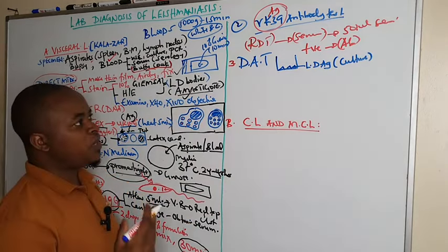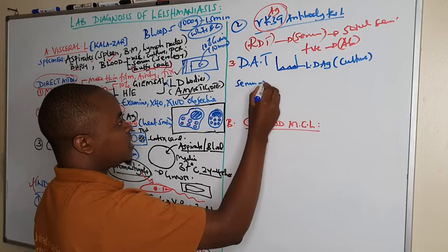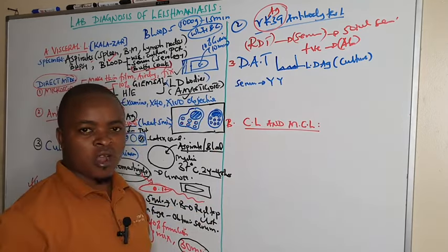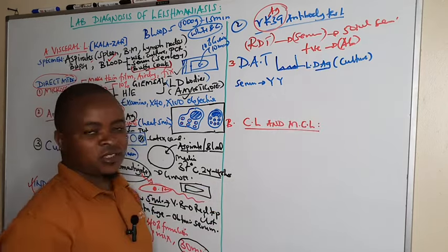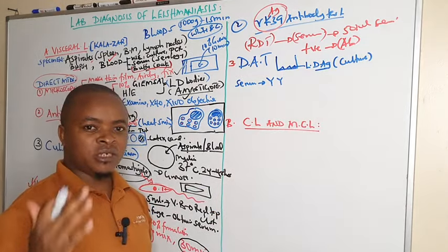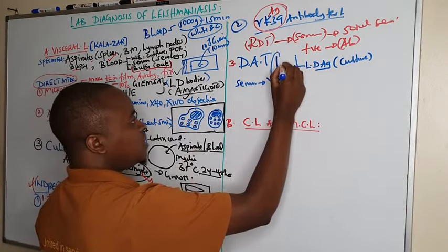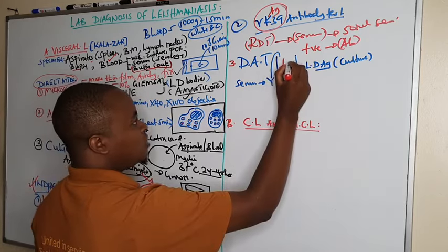You obtain the patient's serum, which we suspect to contain immunoglobulins, or antibodies, specific to the LD antigens immobilized on the well. When we add this serum, the antibodies come and bind to the coated antigens.